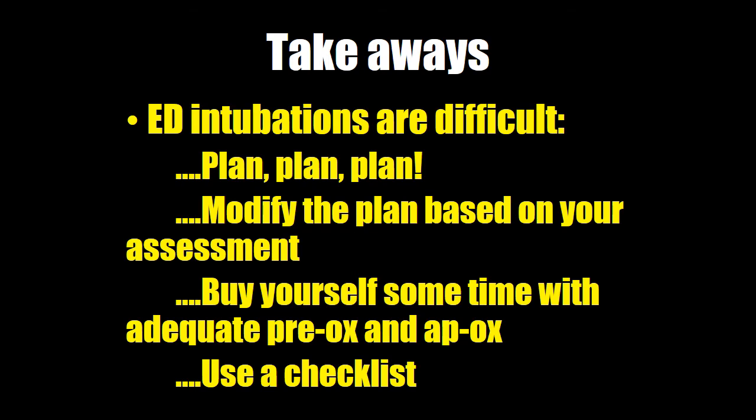We could have an airway mannequin left in here or somewhere else, and we could pull staff off the floor for a 15-minute simulation. I wouldn't even pull staff off the floor, I would do it in resus. Yeah, or do it in resus, because it's all about knowing where everything is. You can either pull the airway trolley off the floor, or we actually do it in the environment we're doing it in. So it is actually a proper muscle memory sort of response.